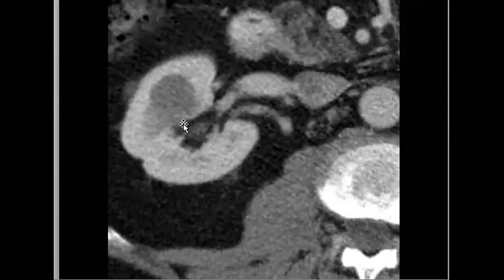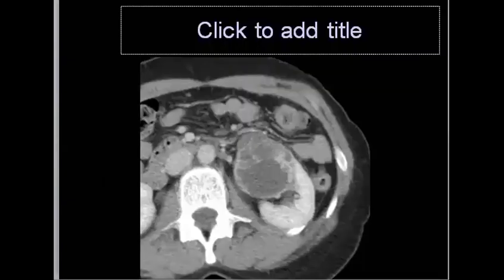So what is the difference between 2F and 3? What is the difference between 2F and 3? Again, we can find something easier now. Okay. What about this one?